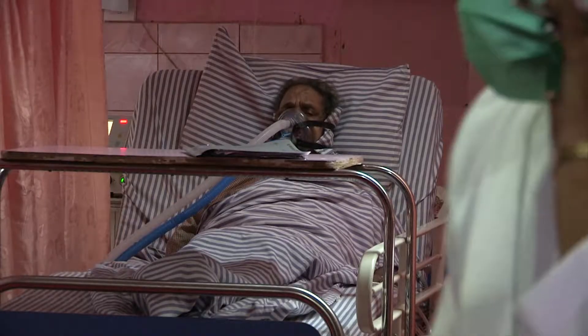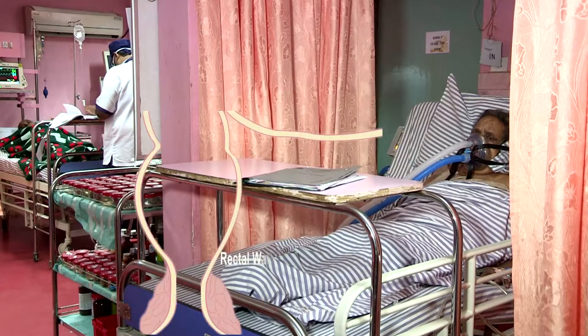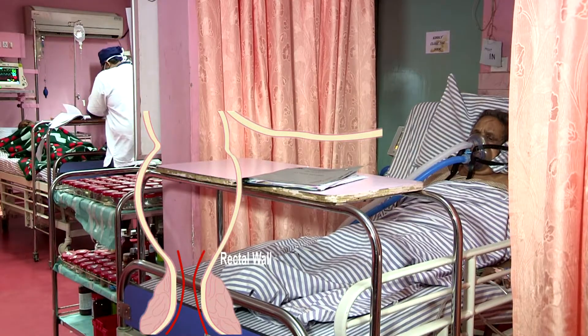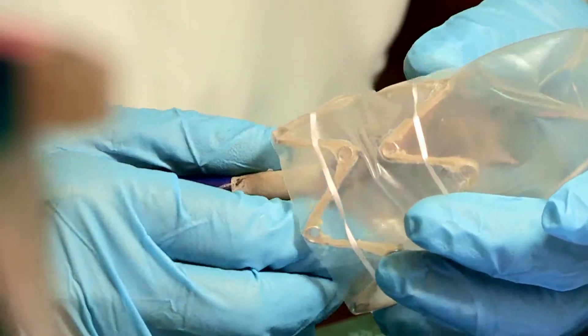The challenge in managing uncontrolled release of fecal matter originates from the poor seal that the device makes with rectal wall of patient. To begin with, Concierge Medical's stool management kit makes sure that this is taken care of effectively.